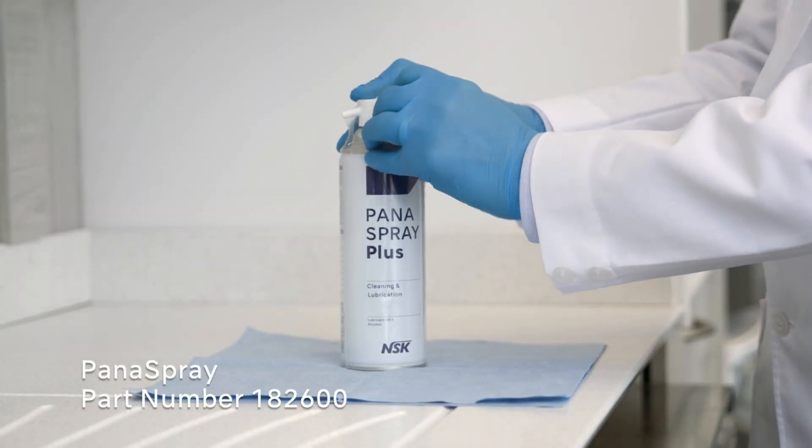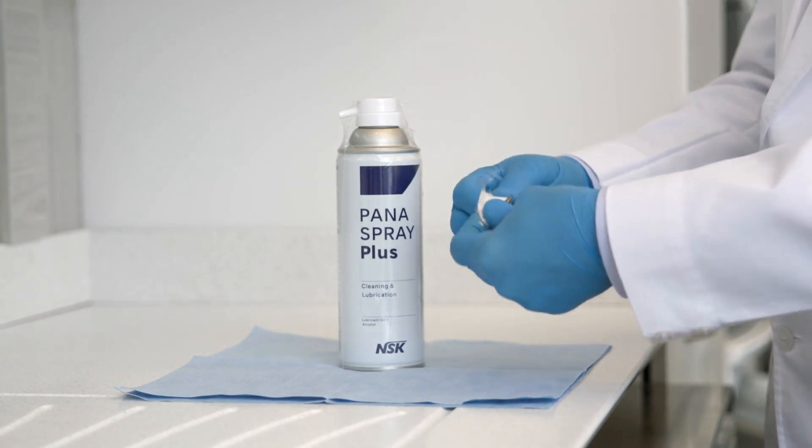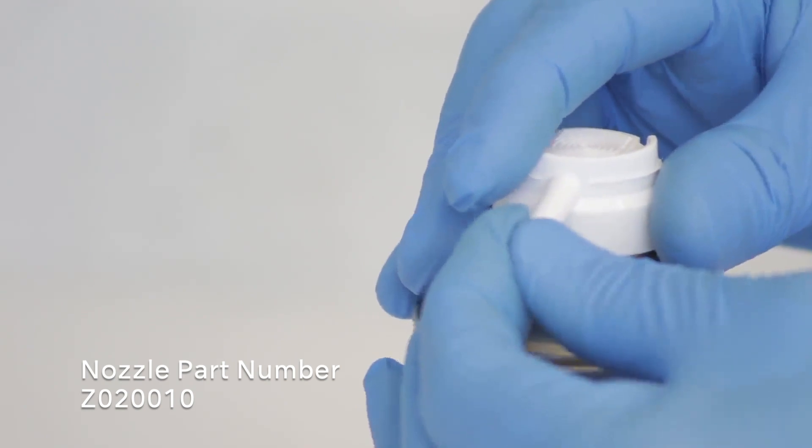Mount the spear-shaped nozzle that comes along with Pana spray and leave it on. If it's missing, you can order the nozzle using part number Z020010.